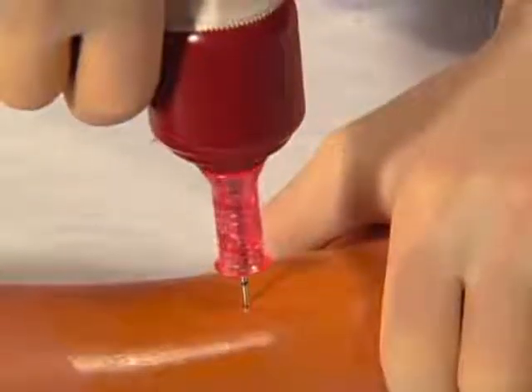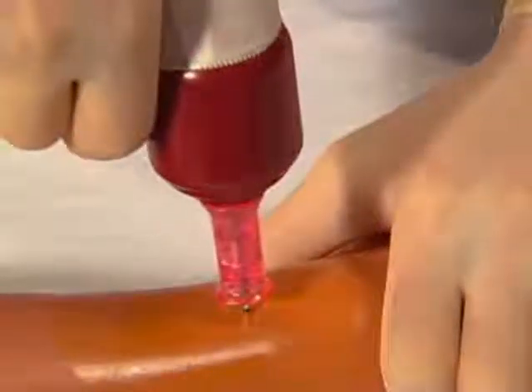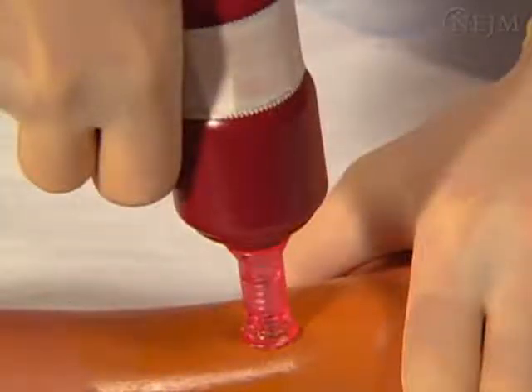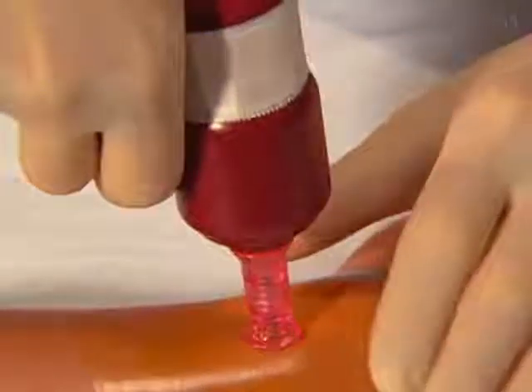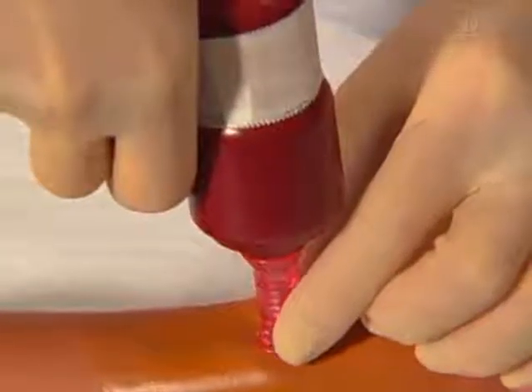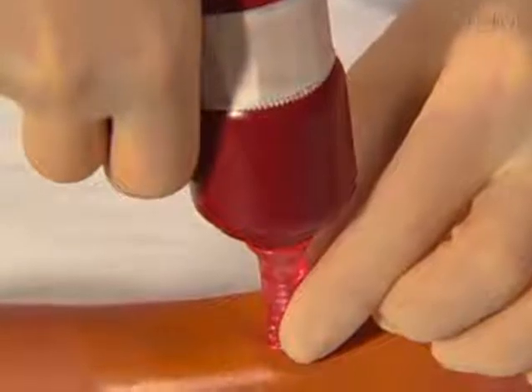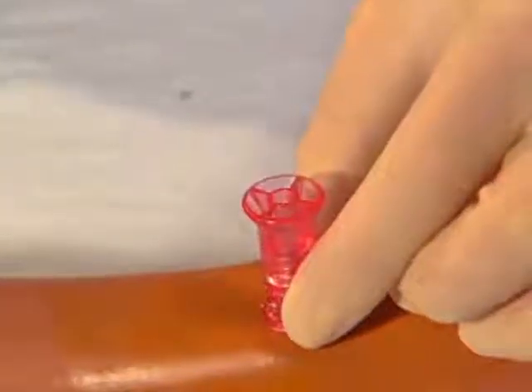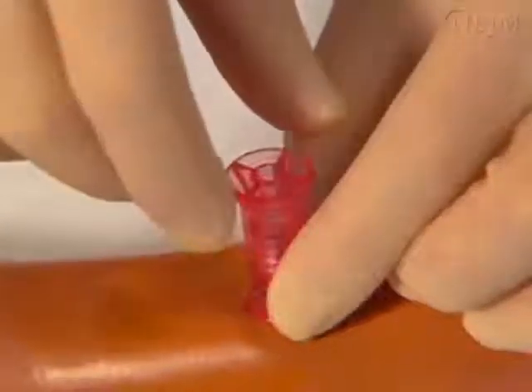Apply gentle, steady pressure while engaging the trigger to allow the needle to penetrate the soft tissue and then the bony cortex. Once resistance decreases, marking the entrance into the medullary cavity, take care to release the trigger and allow the driver to stop spinning before pulling back or disconnecting the needle. Gently hold the needle and pull the drill directly backward and off the needle to disconnect.